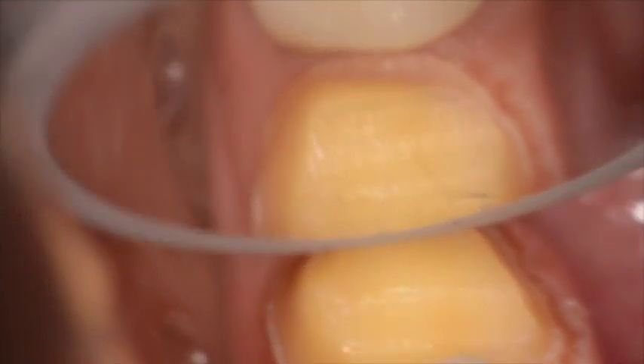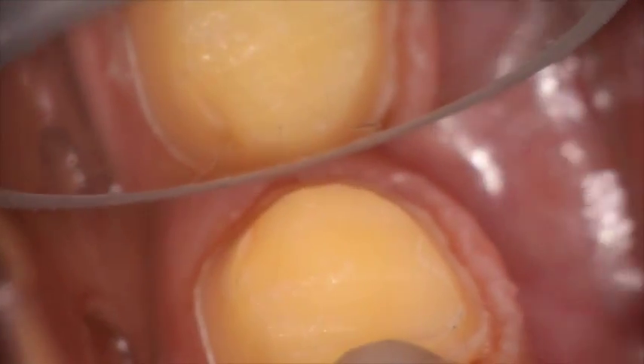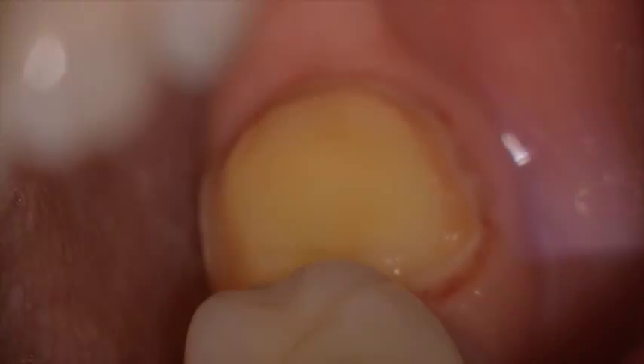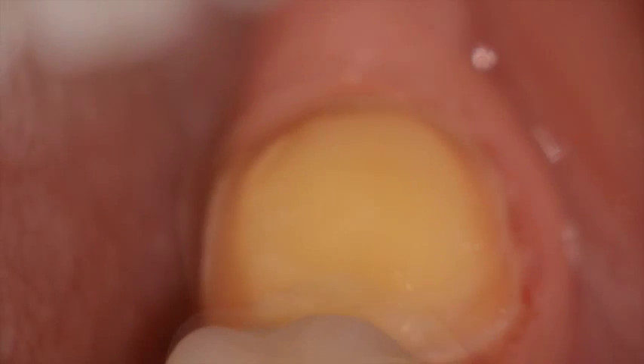As you come around the distal surface to the lingual surface, you can see very clearly the nice detail of the margin that is brought out by using laser troughing. At this point we bring over the vinyl polysiloxane material, both light body and putty, and take an impression of the final laser troughed crown.